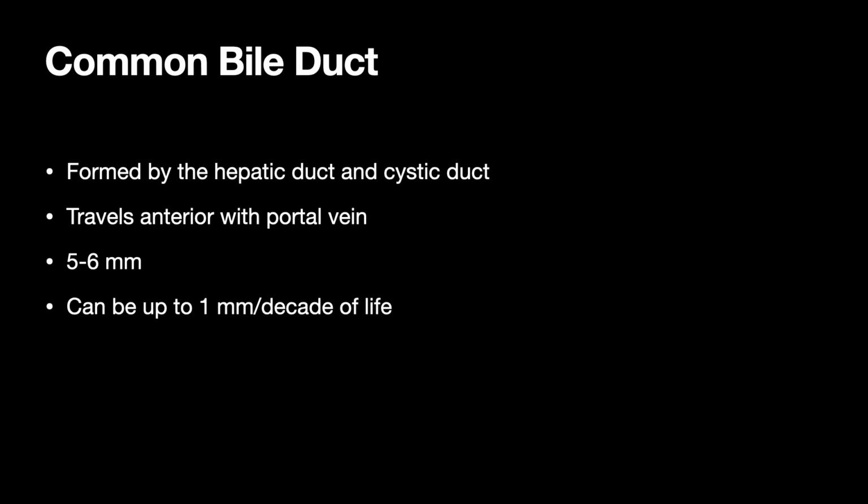I remember struggling for many, many years as I was scanning through gallbladders, like I can't find the CBD. I can find the gallbladder, I can follow that, but I cannot for the life of me find the CBD. And when I started working that progression of, I found the gallbladder, I used the gallbladder to help me find the portal vein. Once I found the portal vein, I'm in the neighborhood where I need to go, and then the CBD is kind of right there.